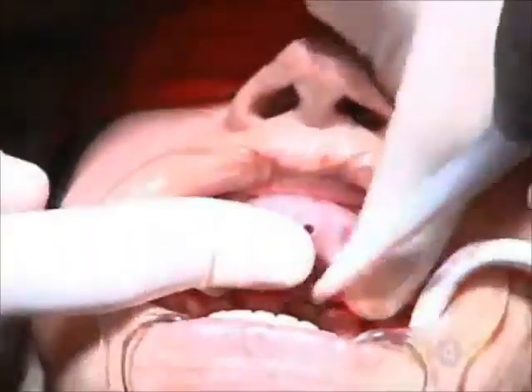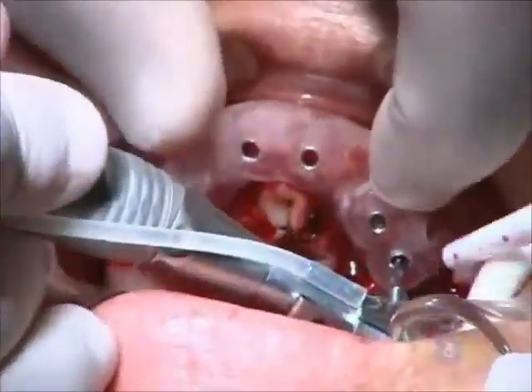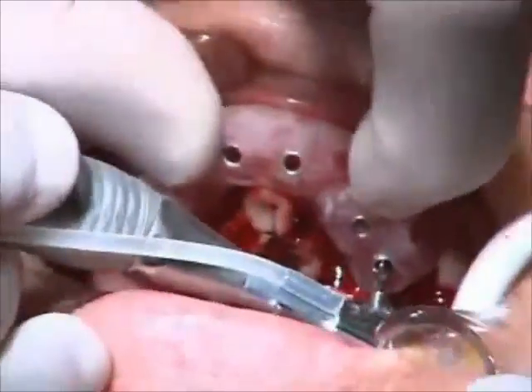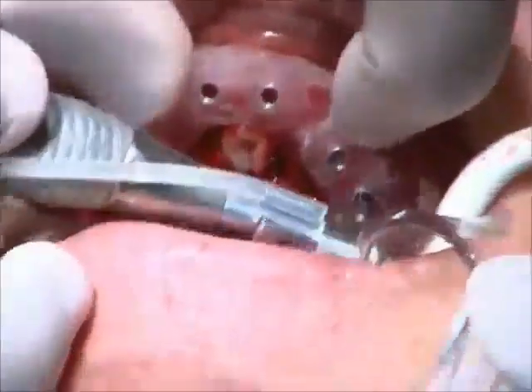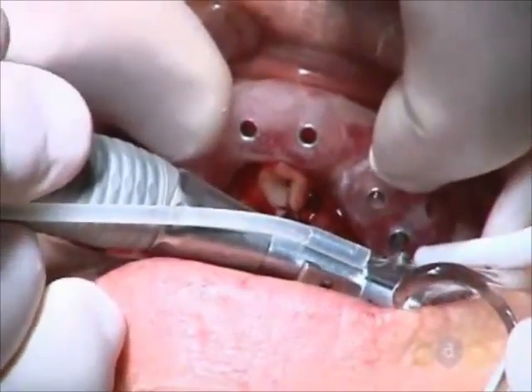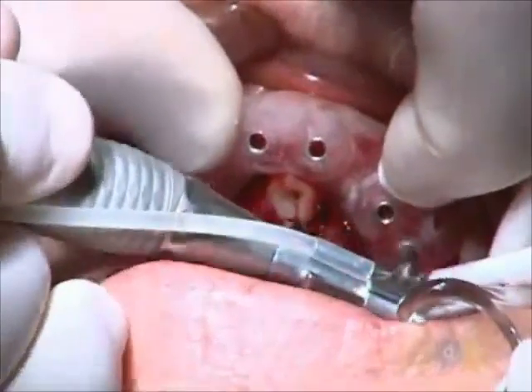I'm then going to remove this. And I'm going to go to the final guide, which is dedicated for the size reamers I'm going to use for the 3.5 diameter implants. So this really allows us to place the implants exactly as we did on the CAT scan machine. So we've really taken this to another level.